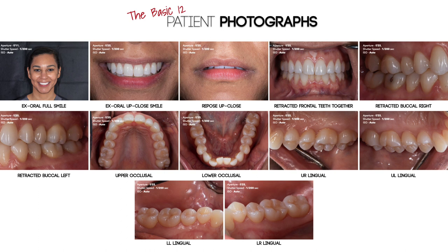My typical photo series is what I call the basic 12. These are 12 patient photographs that I use for the majority of the patients I plan to treat. I don't document all of my patients, but if I'm going to do a decent amount of work on a patient, or if I think it is an excellent case to document, I will often use the basic 12 photo series as a starting point. I will typically take these 12 images before and after treatment.